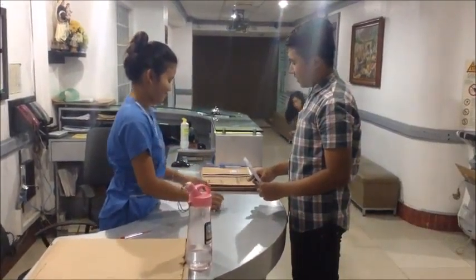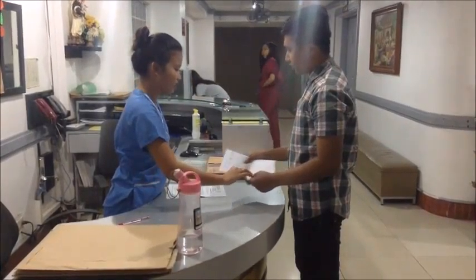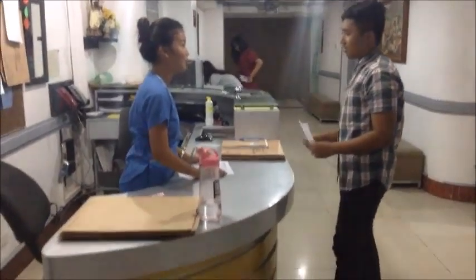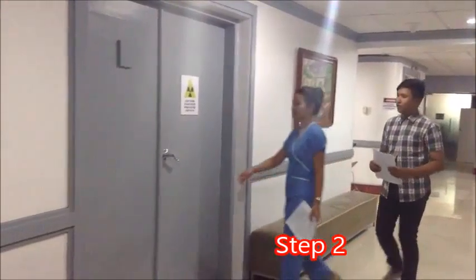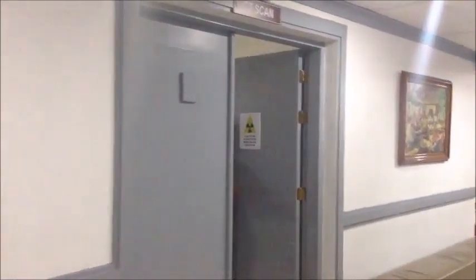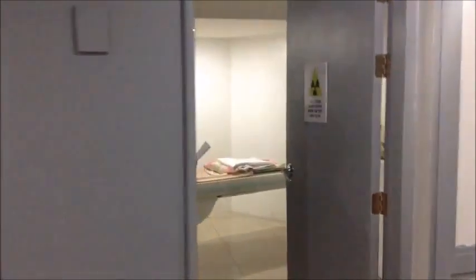If the patient has a history of allergy to contrast materials such as iodine, the requesting physician and radiology staff should be notified. A CT specialist will greet you and bring you to the exam area. These technologists have completed a regular course of education and training, and work under the close supervision of the radiologist to assure the most accurate results from your examination.